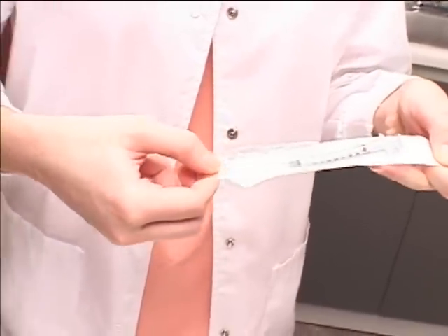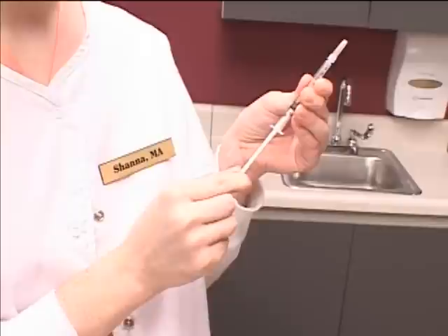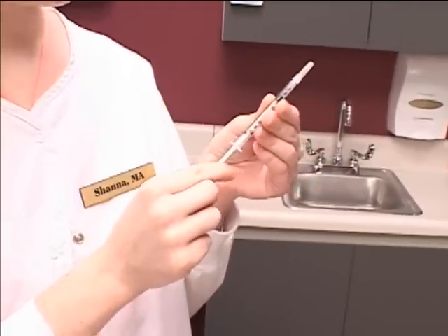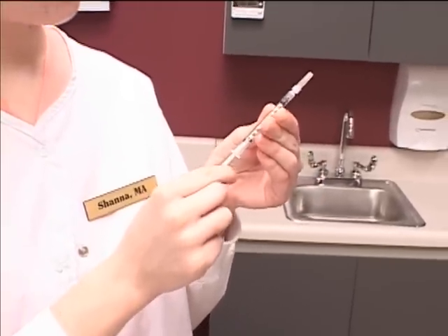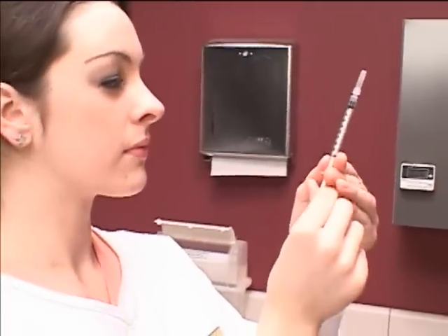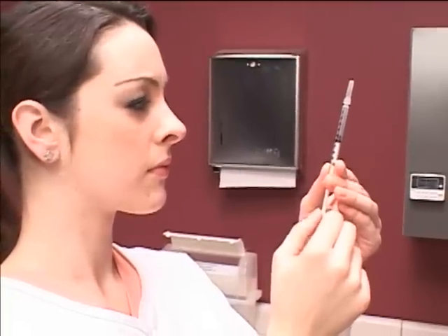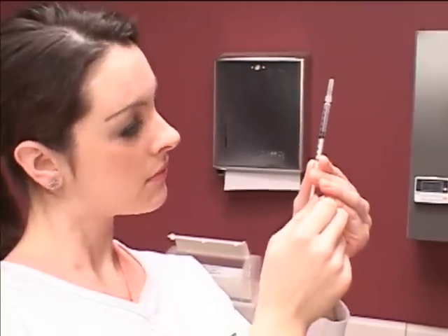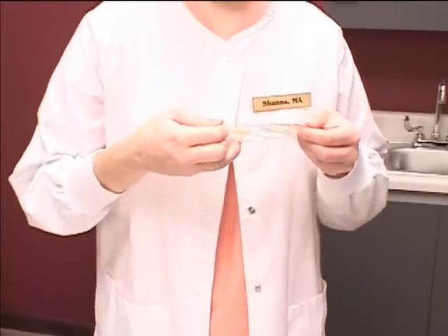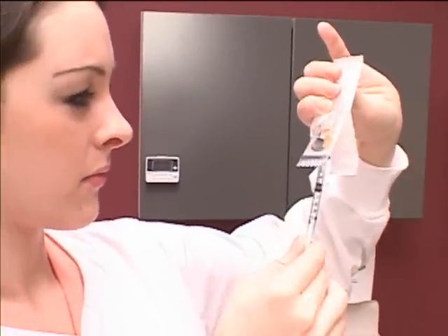Open the syringe and needle. Be careful not to contaminate the items when opening. Loosen the barrel of the syringe by gently pulling the plunger back and forth. While holding the syringe at eye level, pull the plunger back to fill it with air to the desired volume of medication. Being careful not to contaminate, unwrap the needle and attach the needle to the syringe.